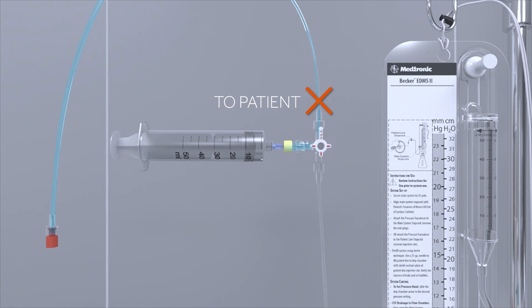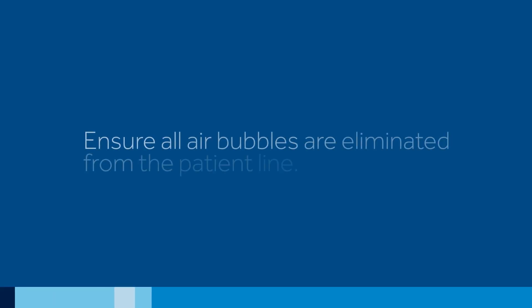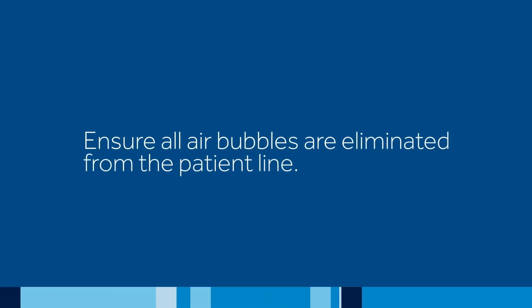Rotate the patient line stopcock 180 degrees so that it is pointing towards the portion of tubing which connects to the patient's catheter, allowing fluid to be pushed from the sampling site in the direction of the drip chamber. Prime the patient line all the way through to the drip chamber. Ensure all air bubbles are eliminated from the patient line.